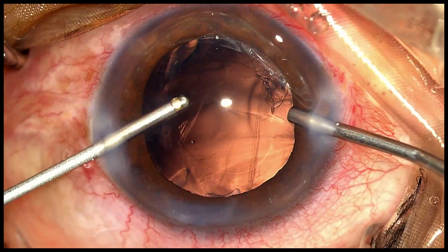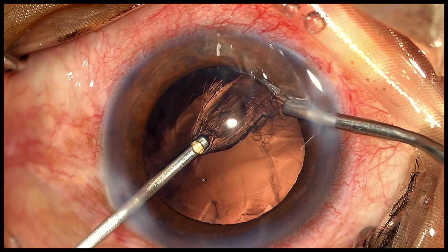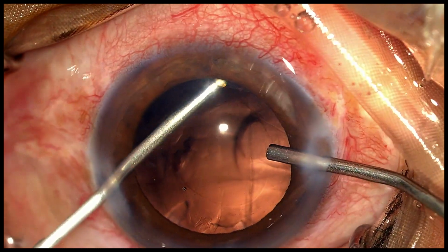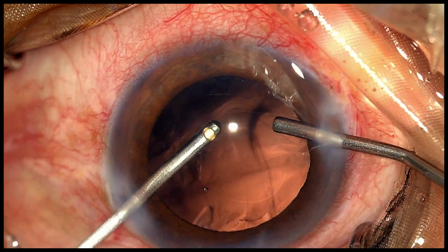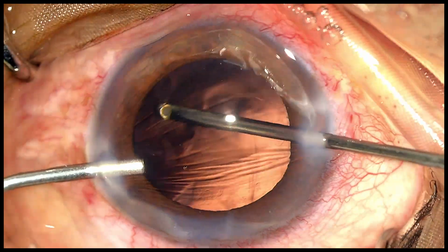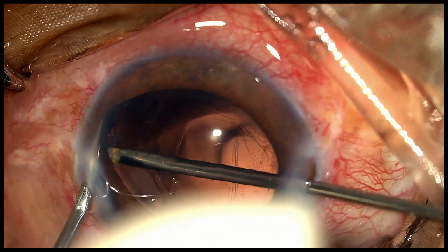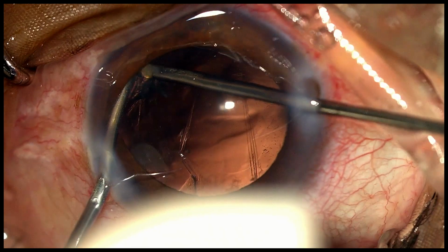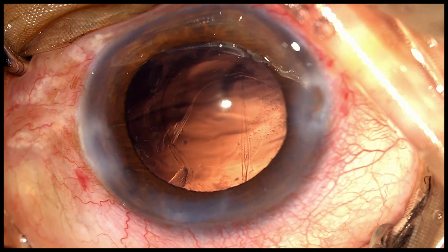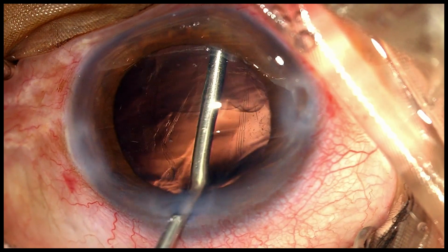In the same manner, the inferior cortex is removed by now introducing the vitrector on the left side and going in the IA cut mode of the vitrectomy to remove the inferior residual cortex. The residual cortex from the 4 and 5 o'clock position are removed after retracting the iris with the irrigation itself. This now completes the removal of the cortex, the epinucleus and the disturbed vitreous.